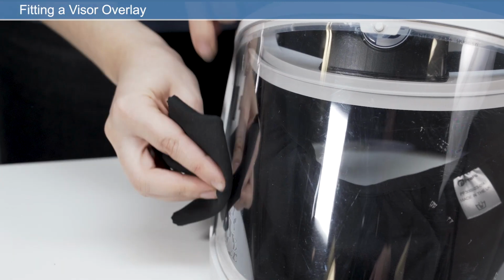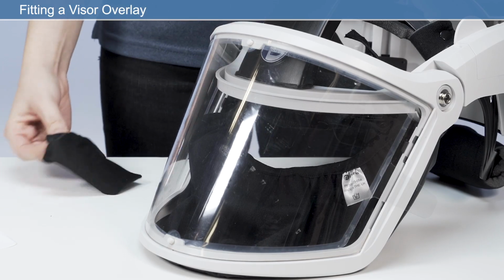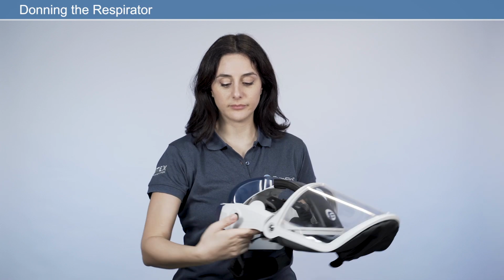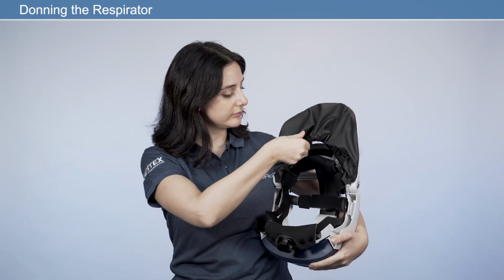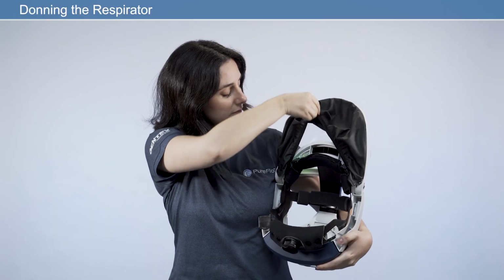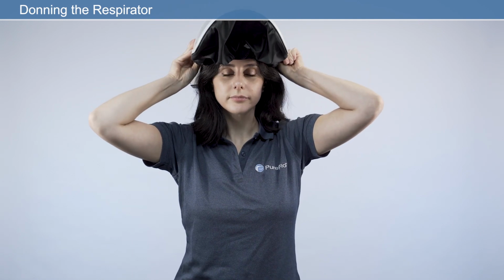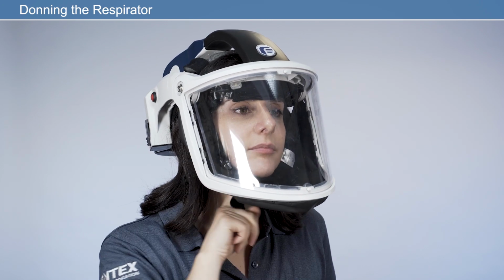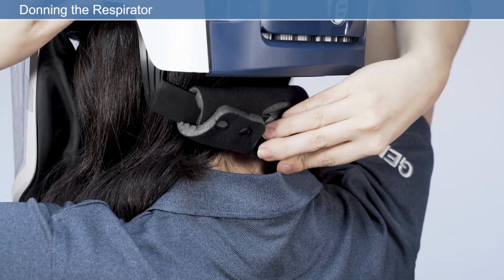Once your respirator is adjusted to your own personal fit, donning your respirator is quick and easy. Donning the respirator. Switch the unit on using the on-off button on the side of the respirator. To ensure the unit is working correctly, check that the LED status indicator is showing green. Firmly close the shield by pulling the tab located on the face seal to lower the visor. Then, ensure the face seal is pulled under the chin and is not twisted or folded. Modify the headband size using the headband adjuster.